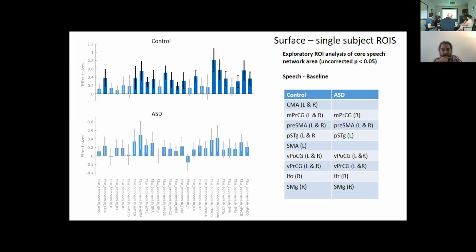There it is. How it comes out on the bottom here with my ROI name. So I call this FSS Right, both Hemi. So if you want to do group, you have to put this. Right. That is, well, it's not a bug. I mean, it's part of a feature, but I can fix it.